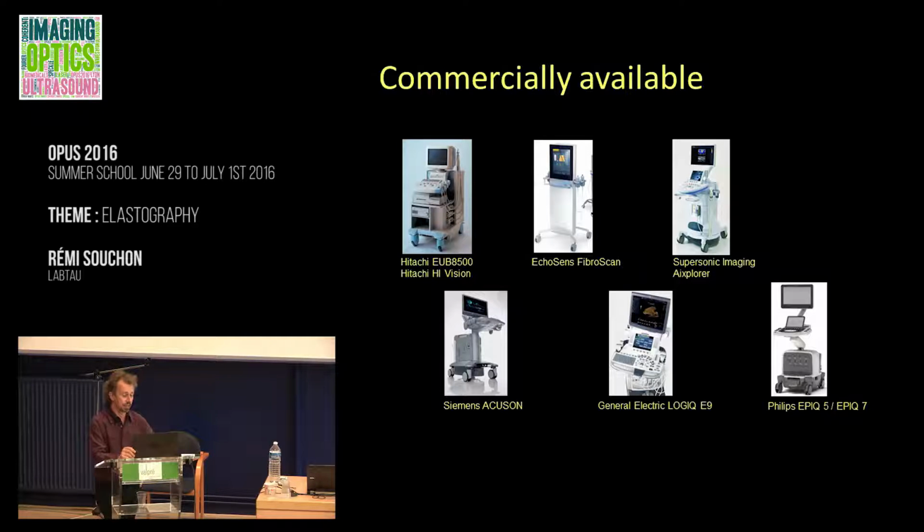And today, the reason why we make elastography so big in this seminar is that it's becoming commercially available to all medical doctors, and even to all labs, as all major manufacturers now offer some kind of ultrasound elastography in their scanner. But we'll be seeing that all these scanners actually cover different techniques.